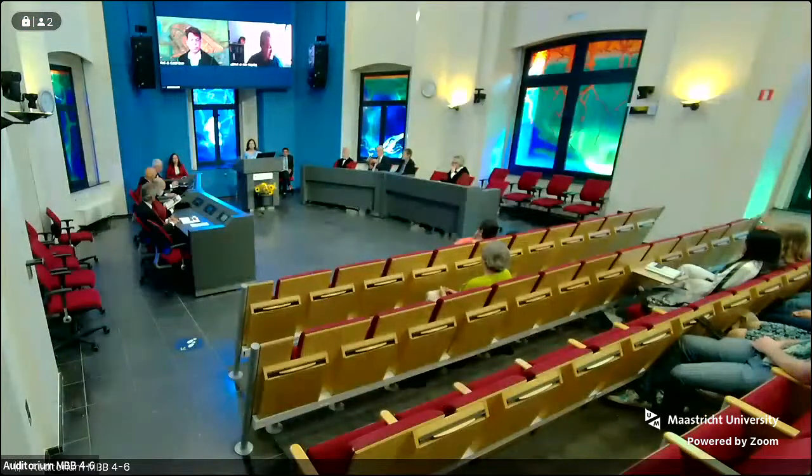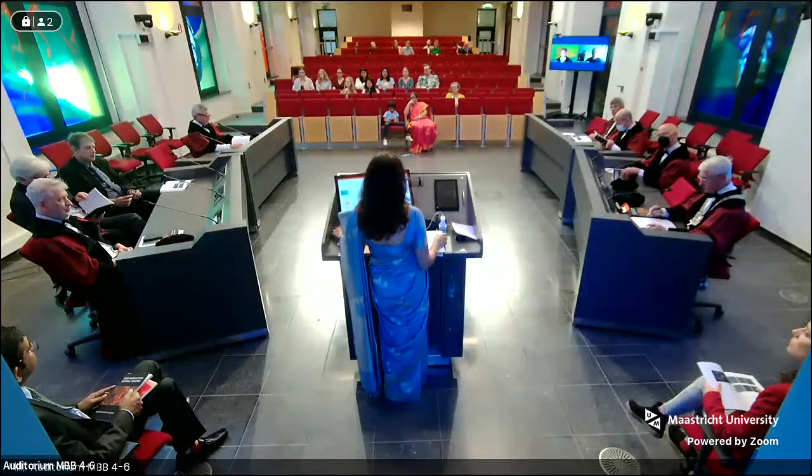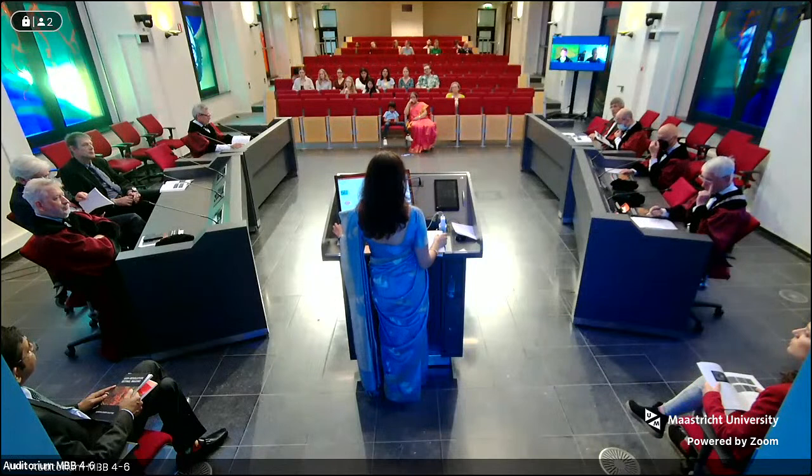Yes, it was. Thank you for your question, highly esteemed opponent. It was taken on the same day. This was in the early days when we still had a prototype of the OCT angiography machine in our clinic. Till then, it was just the fundus fluorescein angiogram, which was the standard of practice to investigate a patient with central retinal artery occlusion. So we first did the fundus fluorescein angiography, and then we were also curious, now that we had the new machine, let's see how it looks on the OCT angiography machine. So it was done pre-paracentesis at the same time, the angiography as well as the initial OCT angiography.